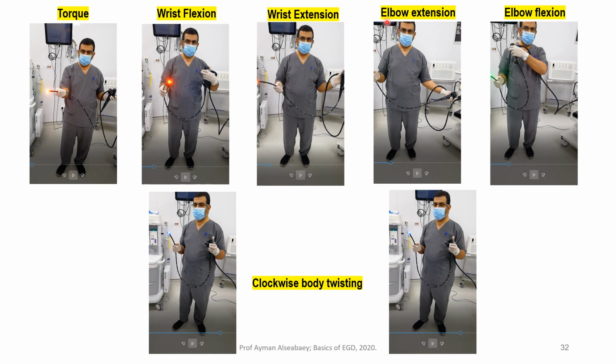The third movement is by using the elbow, okay? If you do elbow flexion like here, the endoscope will go to the right. If you extend your elbow, the endoscope will go to the left. The last type of movement is by using the body twisting. Fix your legs and try to twist your trunk. If you move like this clockwise, by twisting your body toward the right, the endoscope will go to the right. And if you do the opposite, the endoscope will go to the left on the screen.